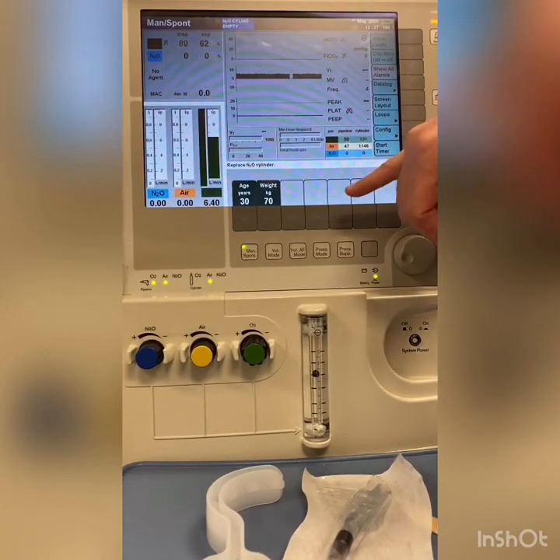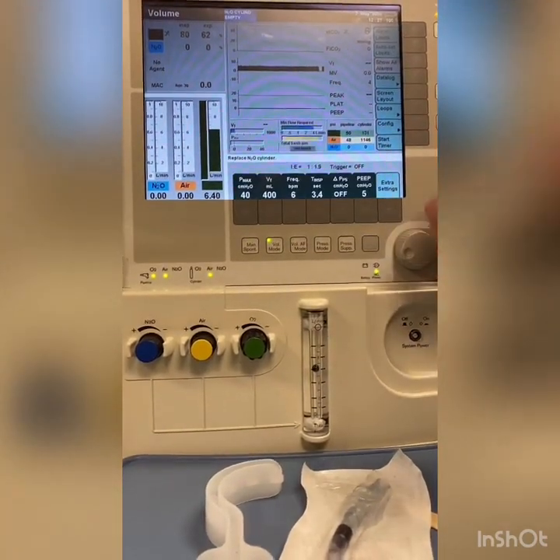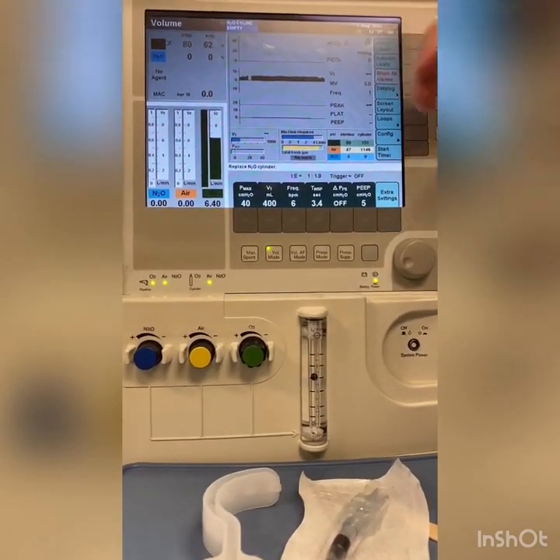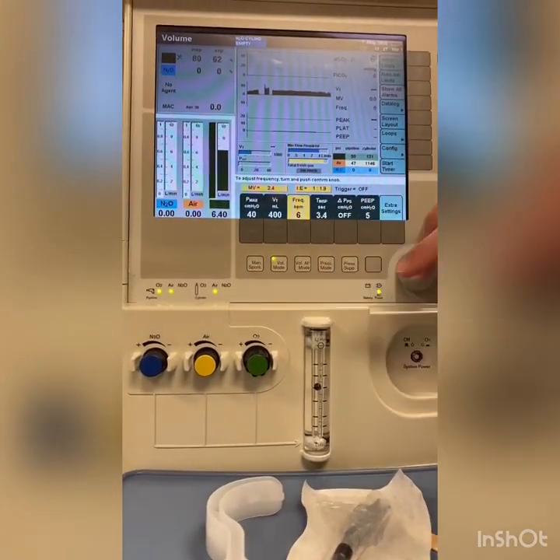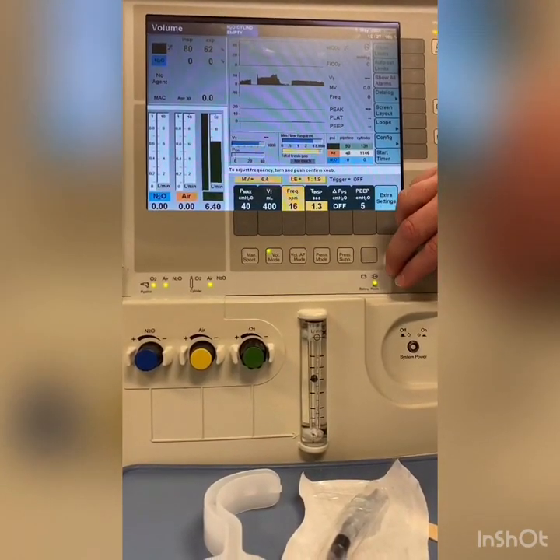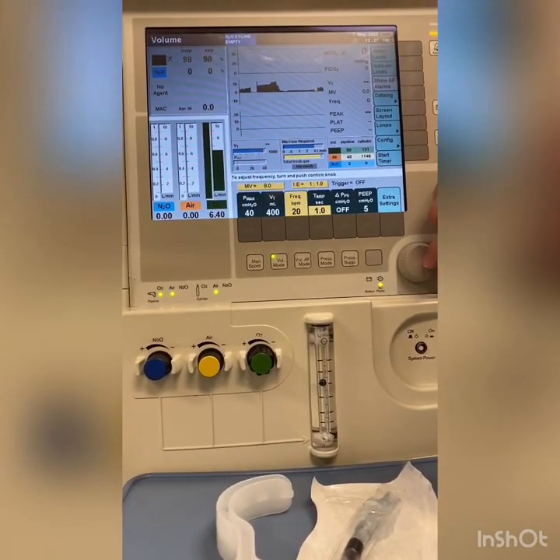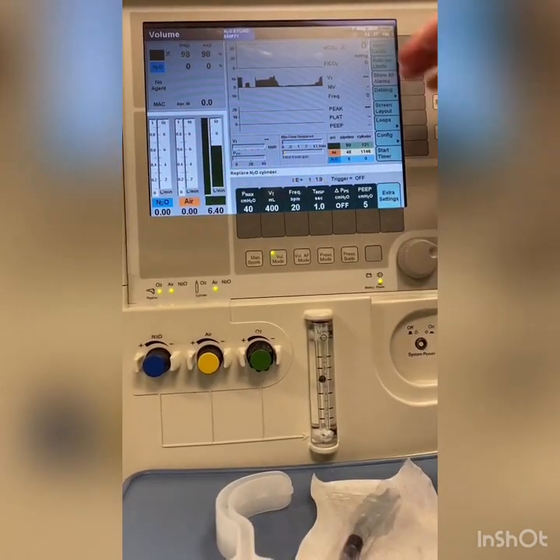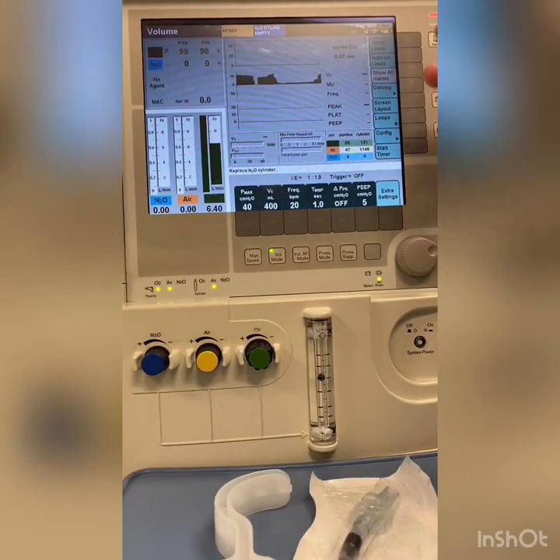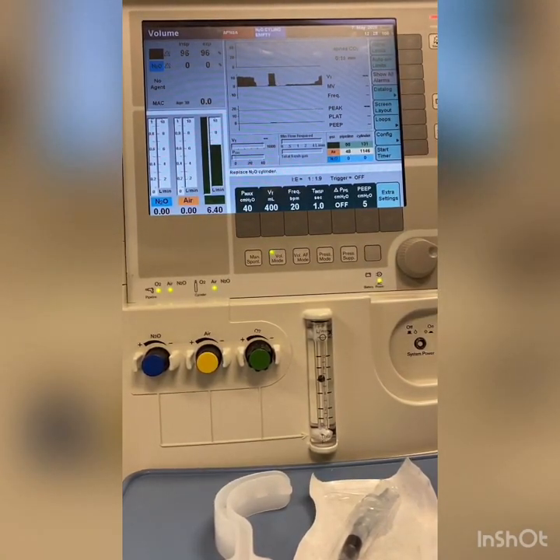And just to touch on that, when we are in the middle of the case, if I want to lower, I'm going to do all my adjustments on frequency first. Okay, let's say I get up to 20 breaths per minute and I'm still in the 50s for end-tidal CO2 during the middle of the case, and I'm not wanting to get them spontaneously breathing.